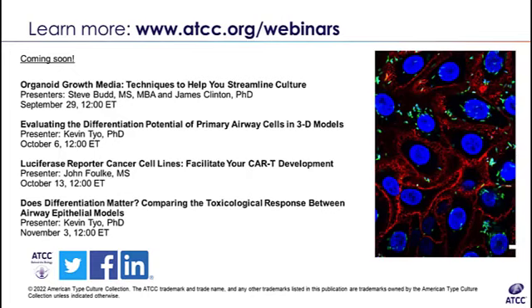Black is not a color that you typically see in cell culture, and if you're not working with melanocytes and your culture is a black color, I would be concerned. Right, and that's exactly what I was shooting for. If you're working with melanocytes, they make melanin, which is a pigment, and that can definitely make your culture medium turn black.